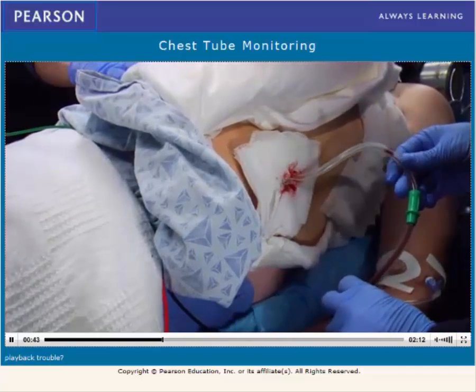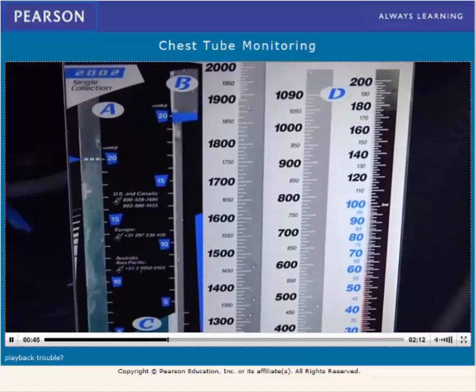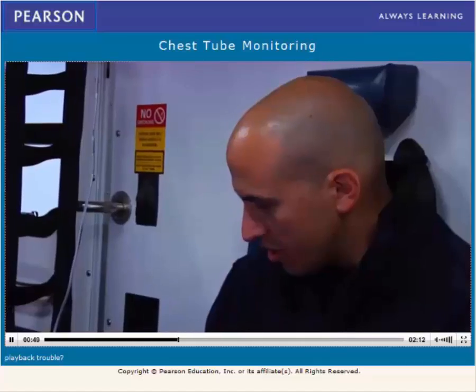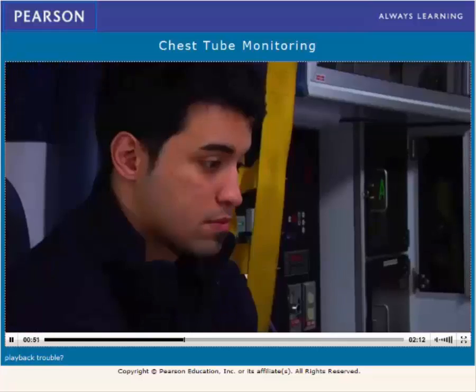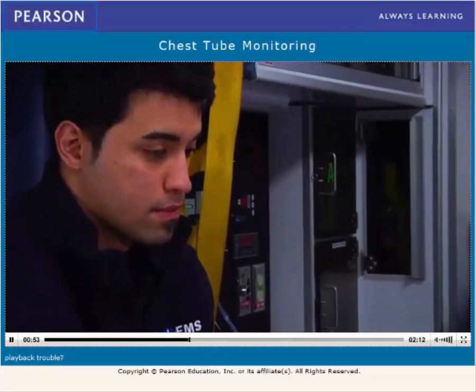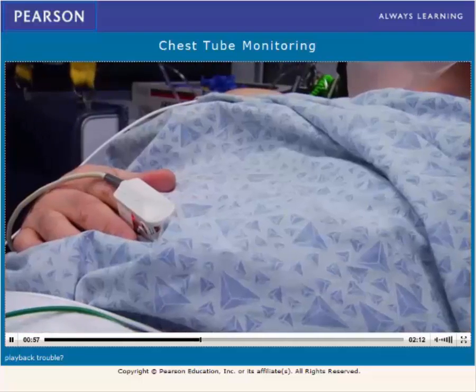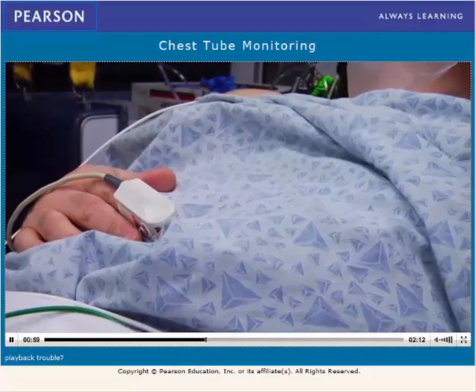Assess the drainage system. Mark the volume and note color and consistency of the drainage. Currently, there's 180 cc's of blood going into the pleurovac at a slow rate. Up to 100 cc's an hour is normal. Excessive drainage should be brought to the attention of medical control.